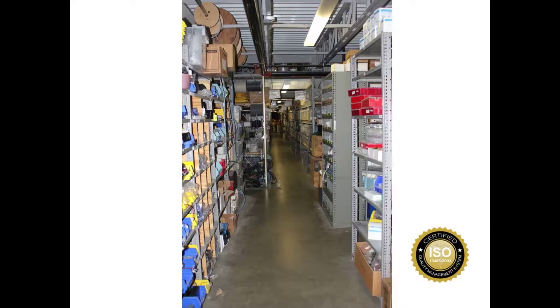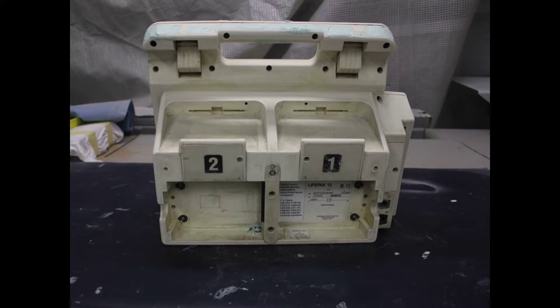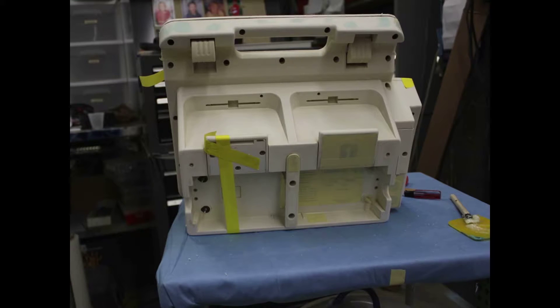From engineering, it goes to our cosmetic refurbishing team — a team of specialty plastics, paint, sanding, and cleaning technicians trained to work with electronics. Scratches and cracks are all filled in. Permanent markers, dirt, and grime are all cleaned, sanded down, and smoothed out. This assures an even and complete coverage of paint and guarantees the integrity of the overall unit.